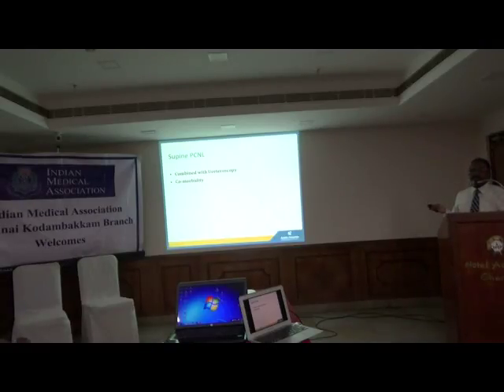And there is supine PCNL, another play, where the patient has a lot of comorbidities, such as COPD, and cannot be positioned prone, or where combined procedures are required. Then we go for supine PCNL, where the patient is positioned supine. The advantage of supine PCNL is we can combine PCNL with ureteroscopy. So the patient will be in supine position, and PCNL tackles the kidney stone, while any ureteric stone can be tackled by ureteroscopy, either semi-rigid or RIRS.